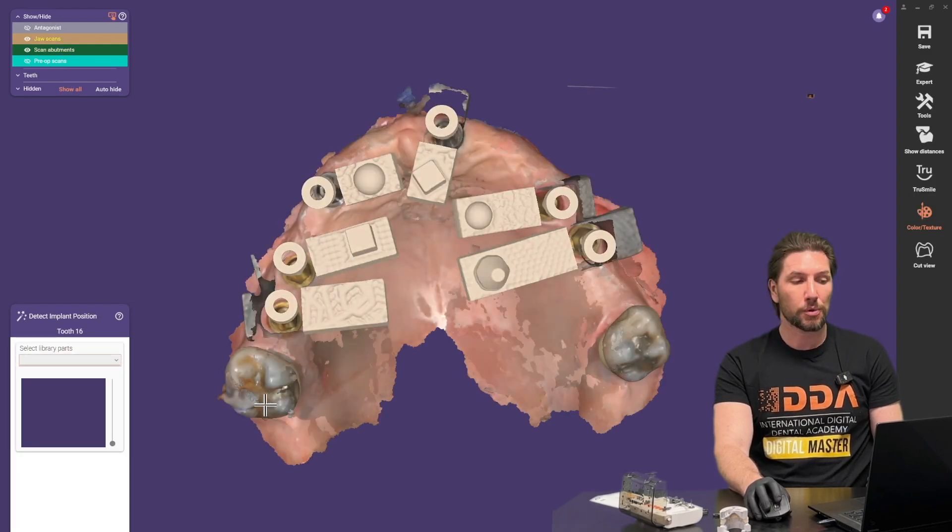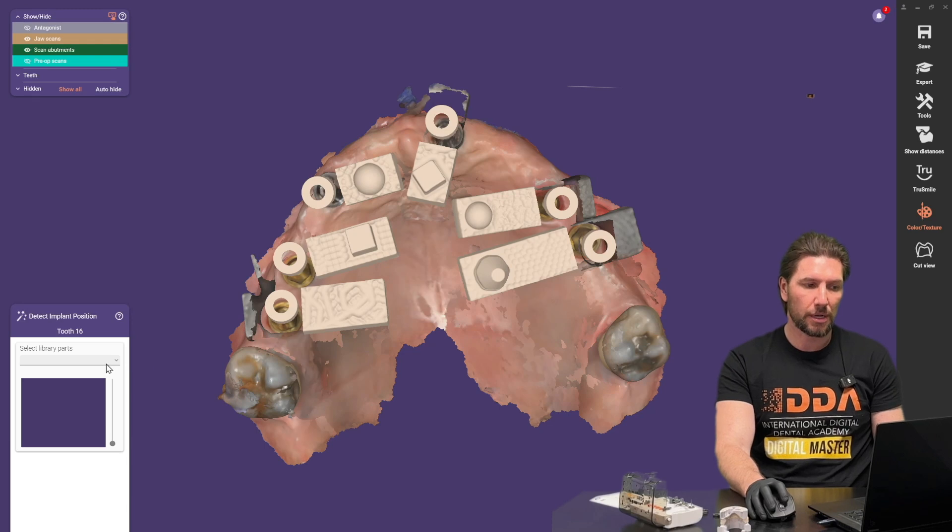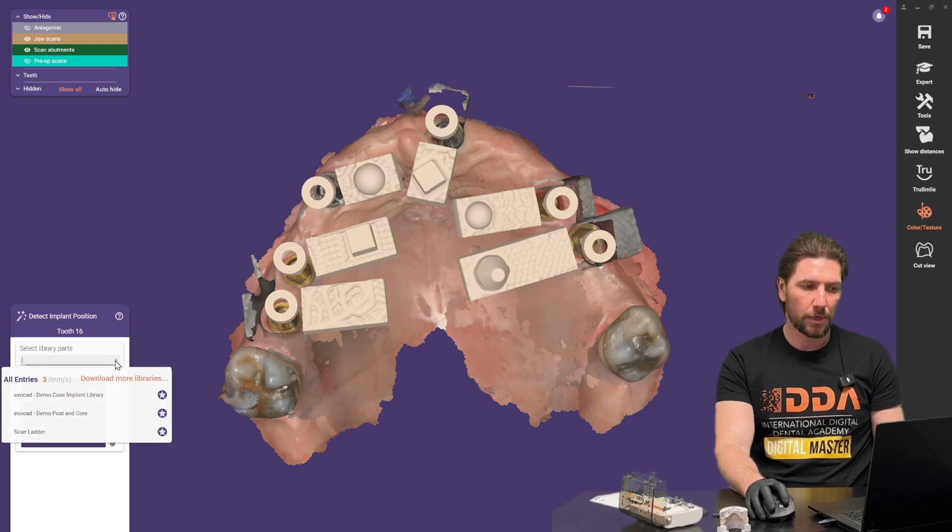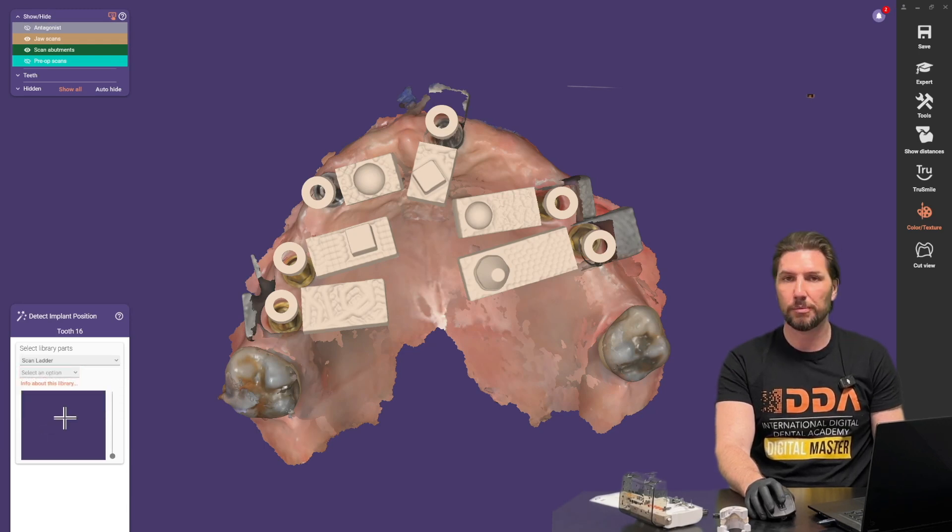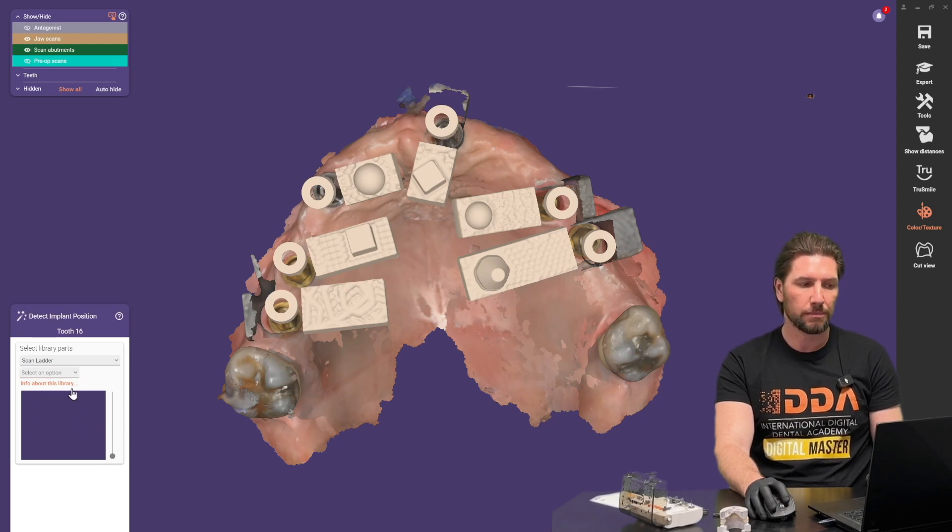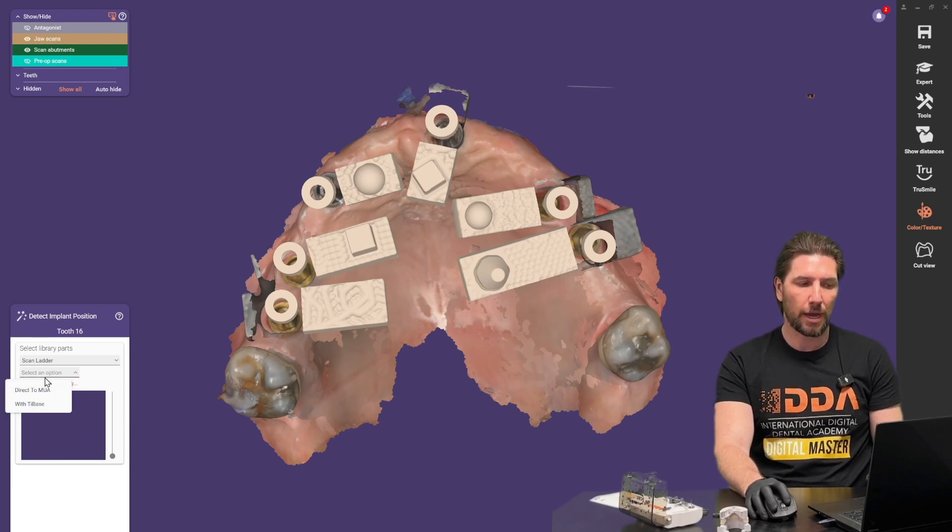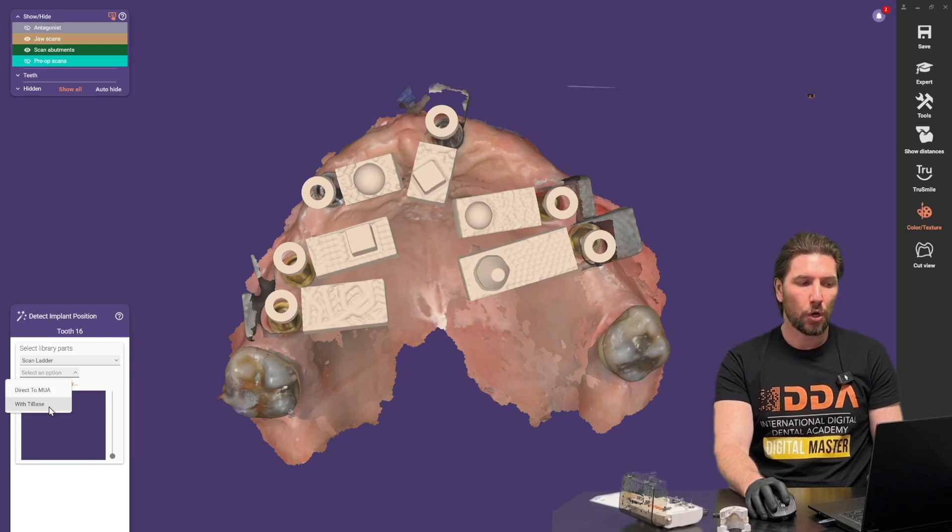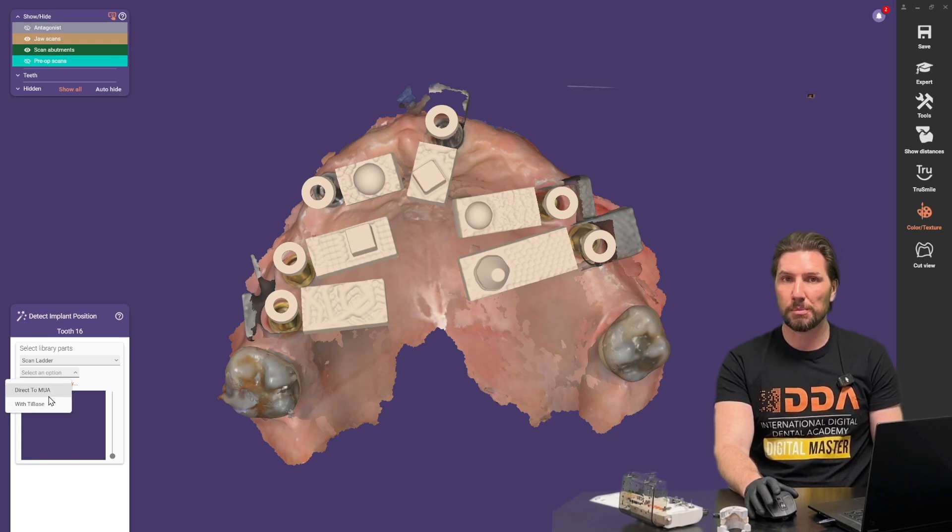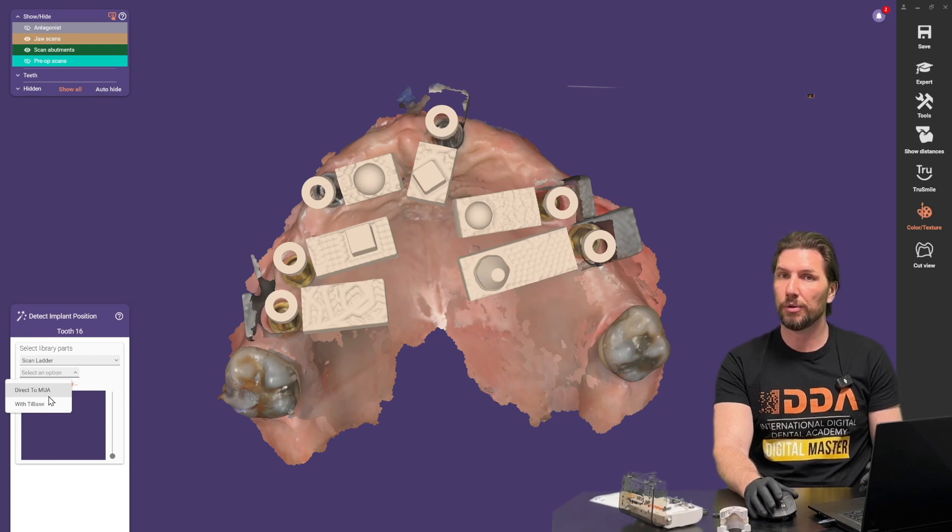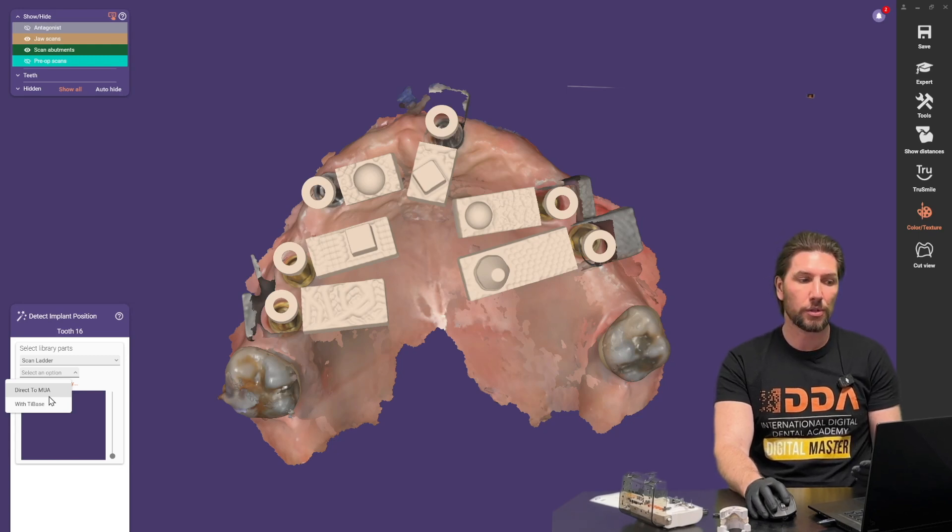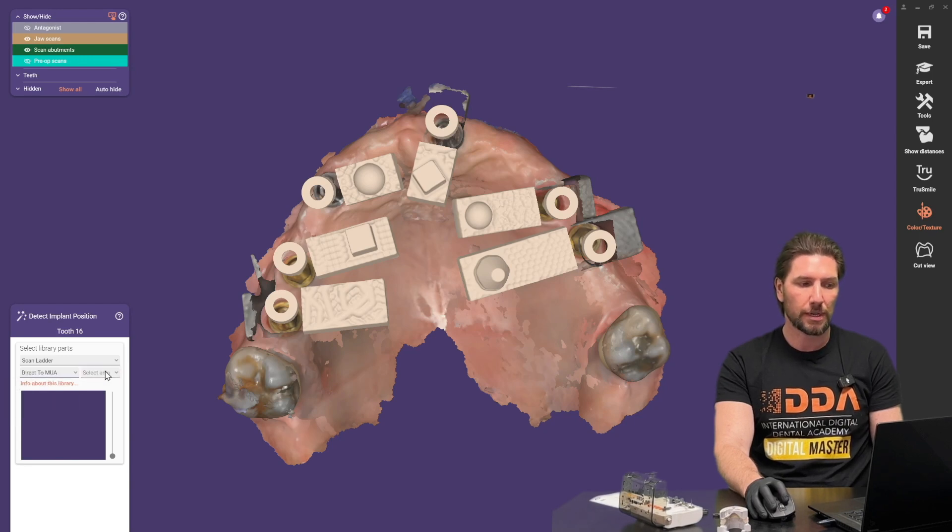So the next stage is we're going to identify the scan bodies themselves. So in your library you should now have the scan ladder library from the install instructions previously. So we're going to connect either with direct to multi-unit or we're going to click with tie base. The choice is yours to make and it depends on what workflow you're going for as to whether you choose something which is going to use a screw which is direct to the multi-unit.